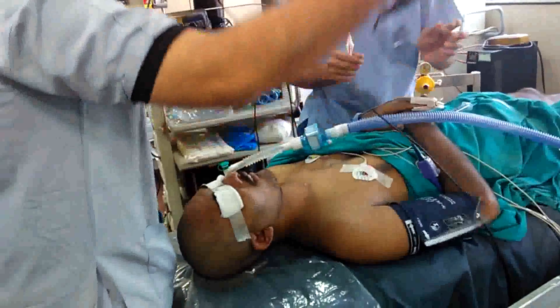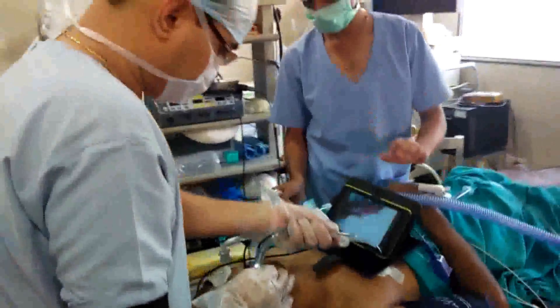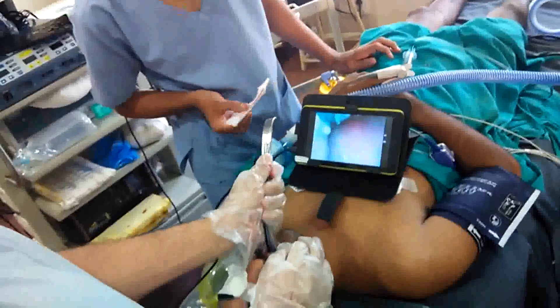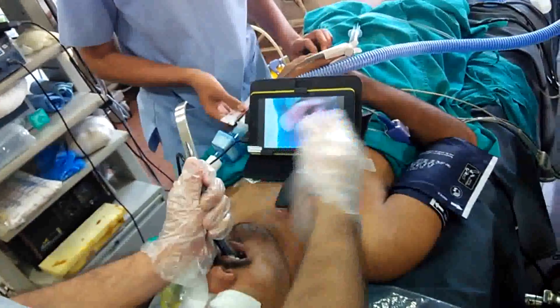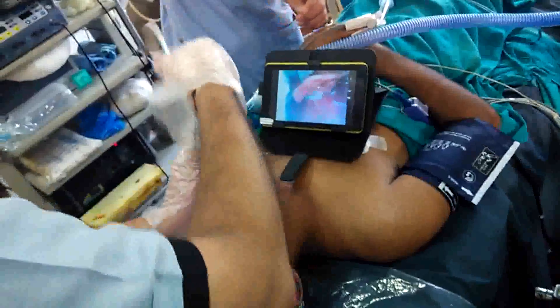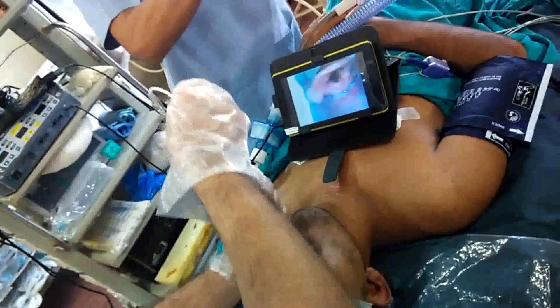We are inserting our video laryngoscope. Here we are able to see the epiglottis and larynx. Are you able to see the larynx? Yes, yes sir.